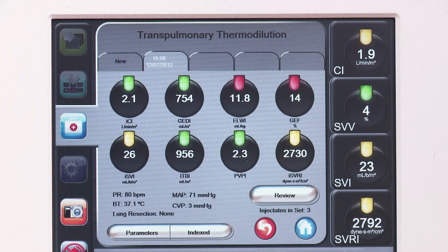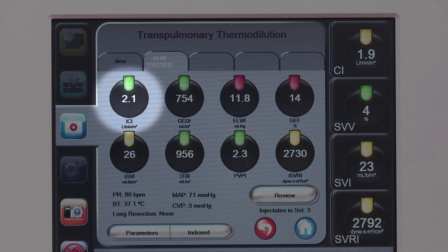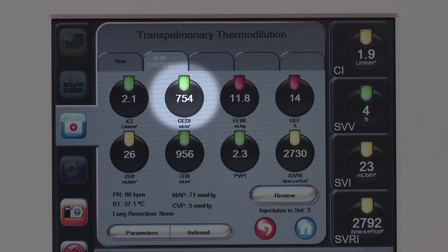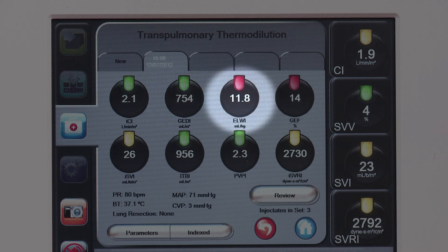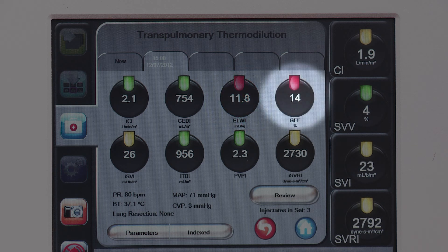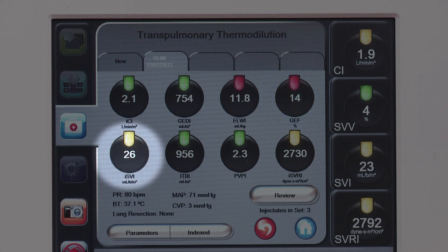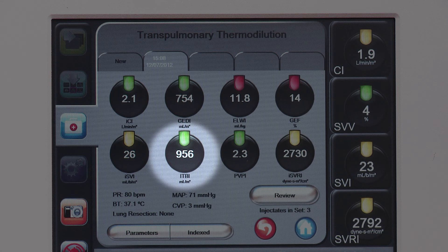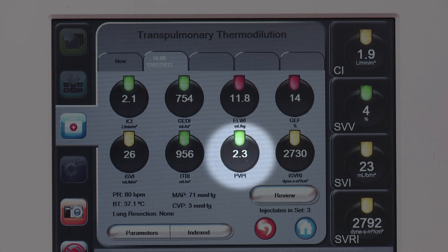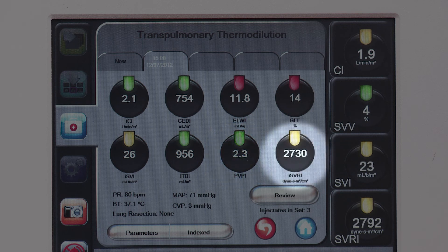The TPTD screen appears with the measured and calculated values for: ICI, Intermittent Cardiac Index; GEDI, Global End-Diastolic Volume Index; ELWI, Extravascular Lung Water Index; GEF, Global Ejection Fraction; ISVI, Intermittent Stroke Volume Index; ITBI, Intrathoracic Blood Volume Index; PVPI, Pulmonary Vascular Permeability Index; and ISVRI, Intermittent Systemic Vascular Resistance Index.